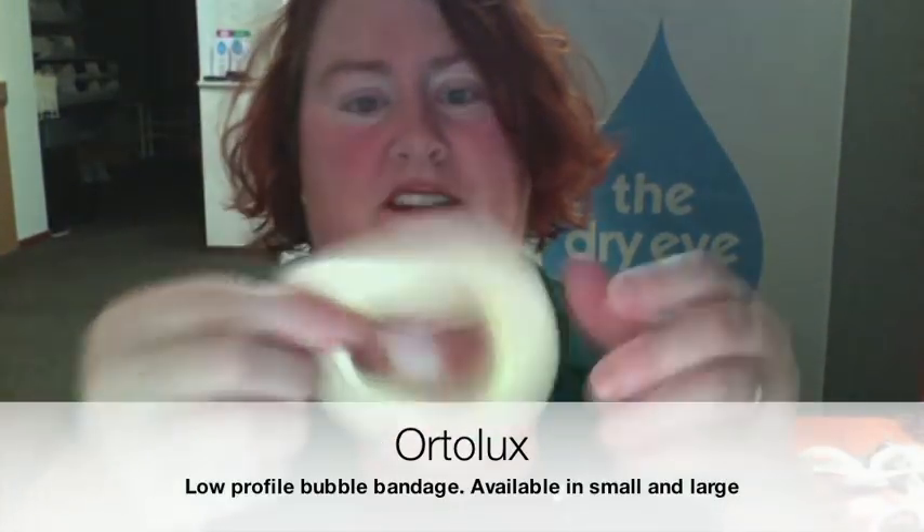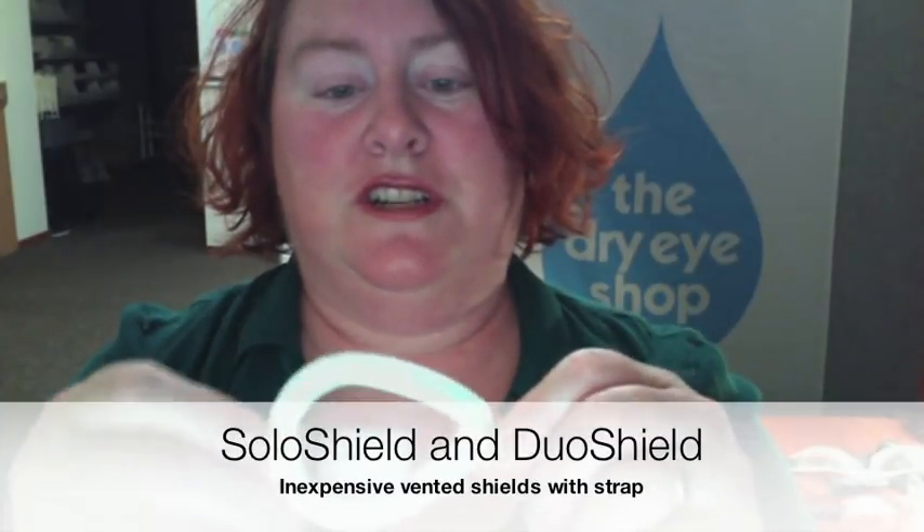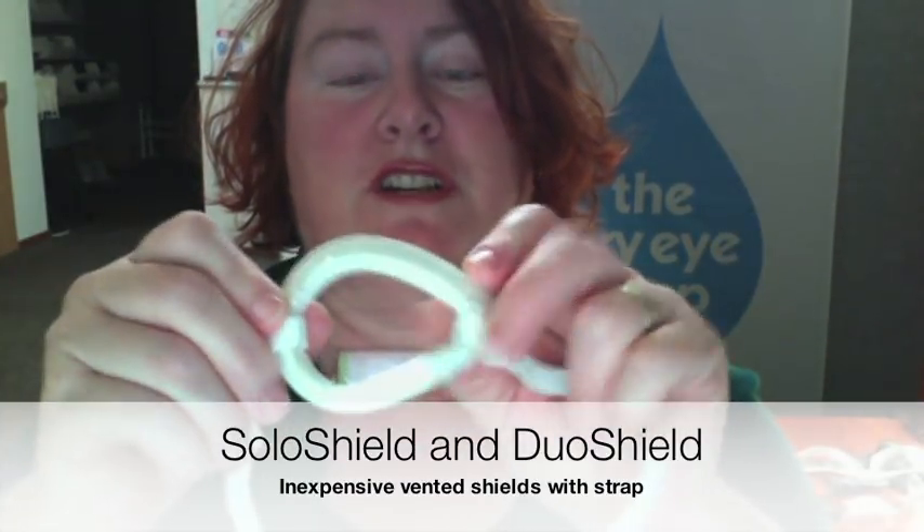There are two sizes of that — you need the extra large, which looks about like that. The next step up moisture-chamber-wise would be something more durable. The bubble patches are great but they are disposable, they get very expensive, and again you've got adhesive against the skin. So then there are inexpensive things that are basically souped-up surgical shields. This is called a Solo Shield — it's like the same kind of tape-on shields you would use after surgery, but with a layer of foam on it and a cheap little strap around it.